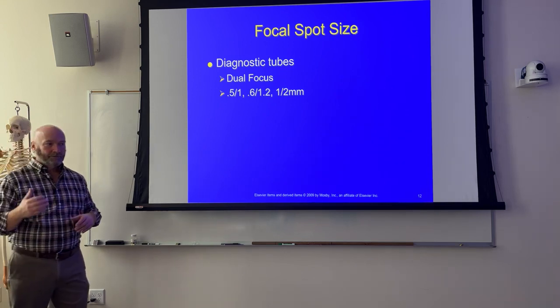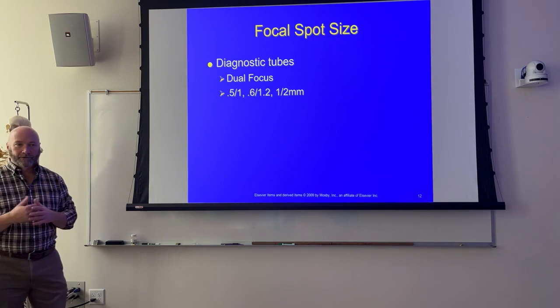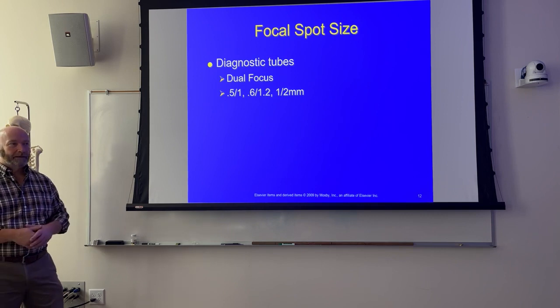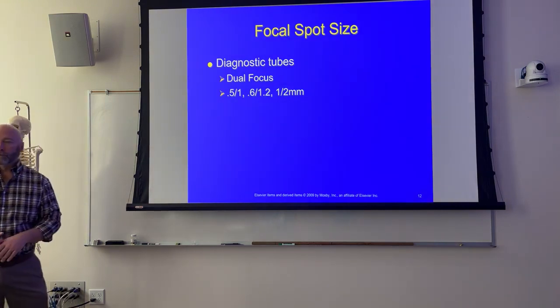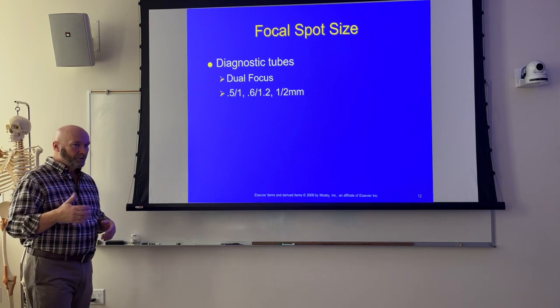Special procedures tubes and CT tubes are kind of similar in some of their aspects and some of their characteristics. So we don't get into CT tubes, totally different modality, as is special procedures, but for some reason we talk about those. All right, so we talk about dual focus tubes. What we're talking about is an X-ray tube that has 2 focal spots.